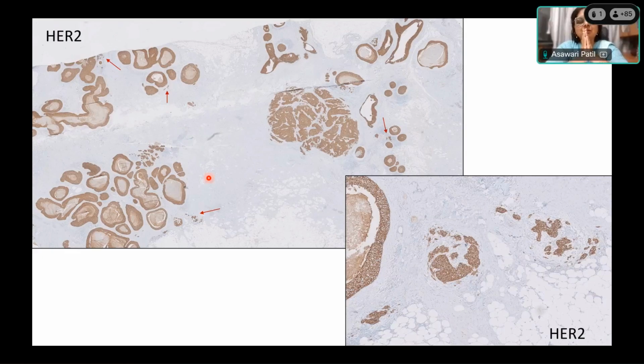So yeah, that's a good question, Dr. Renu. There are no guidelines as such because we are not going to stop. Suppose it's a 5 centimeter tumor, okay? I submit initial 5 sections, but gross examination is definitely important.